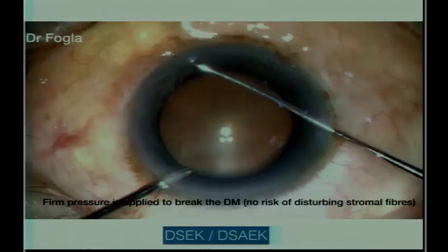Now the problem with the regular Sinskey hook is that the tip, sometimes if you press too much, you will dislodge stromal fibers. So we went ahead and designed a new Descemet stripping hook where the tip is like a ball tip, so it's rounded. So even if you press too much, you cannot really disturb the stromal fibers.